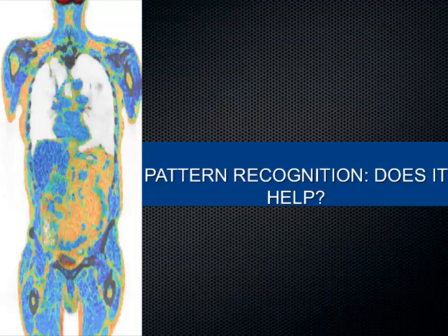Pattern recognition, because in fact the majority of radiology is pattern recognition. Usually you know that's the pathology, and you pick it up because you have seen it so many times, and therefore this is likely to be this. If you use the same formula in nuclear medicine, as we used to, pattern recognition as an intuition, my gut feeling says that this is malignant or benign. But with SPECT CT, that has changed our perception: guessing is not good, so we have to be definitive. And these are a few examples.